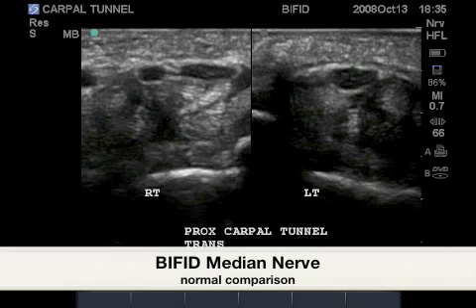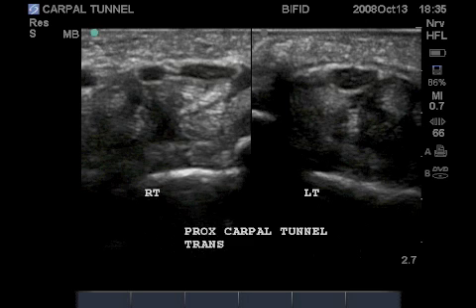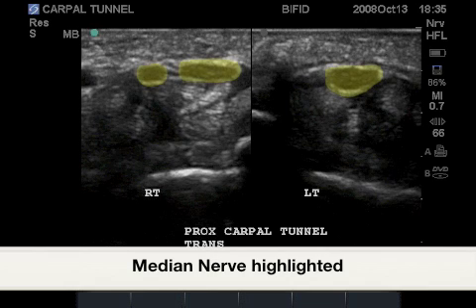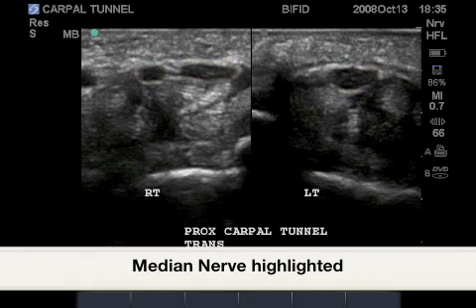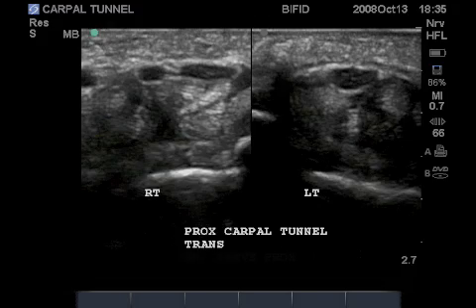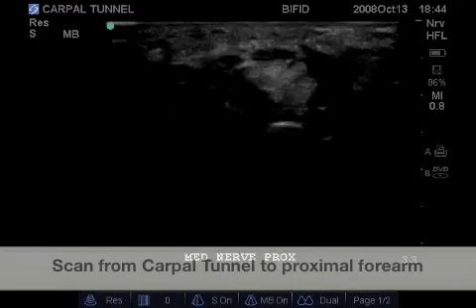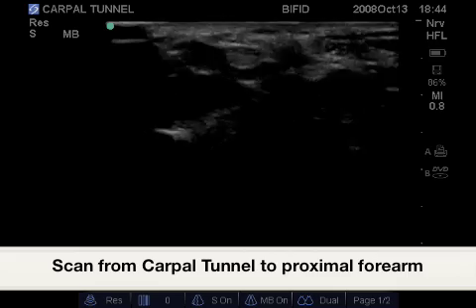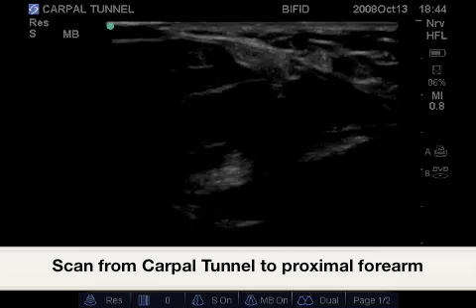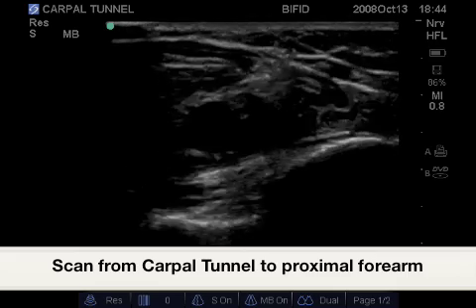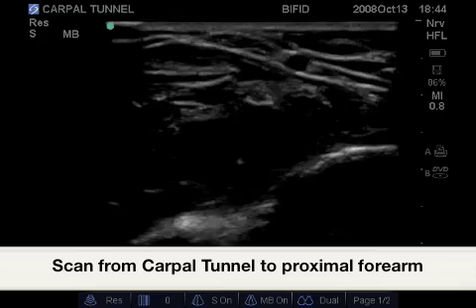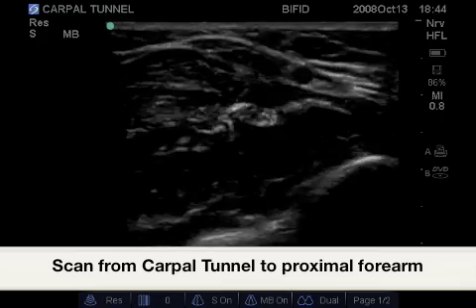Here is a case study involving a bifid median nerve with a comparison to the other hand showing no bifid median nerve. When scanning from the carpal tunnel proximally, it is easy to identify where the bifurcation takes place in the forearm, showing that this becomes one nerve.